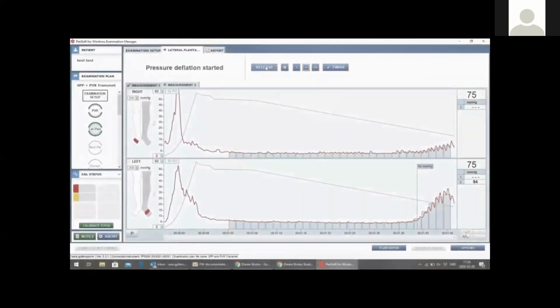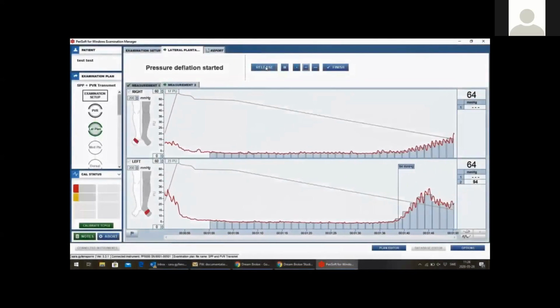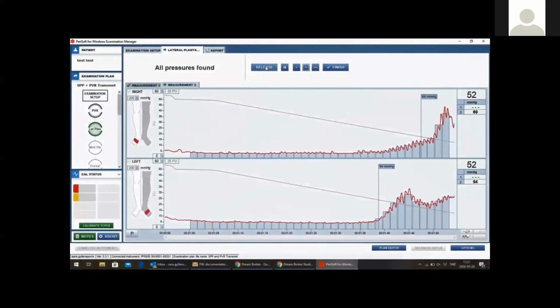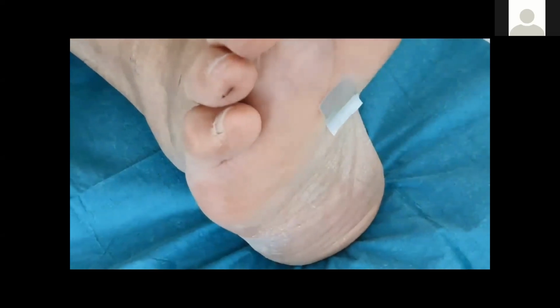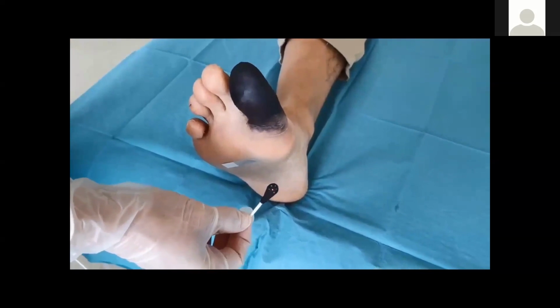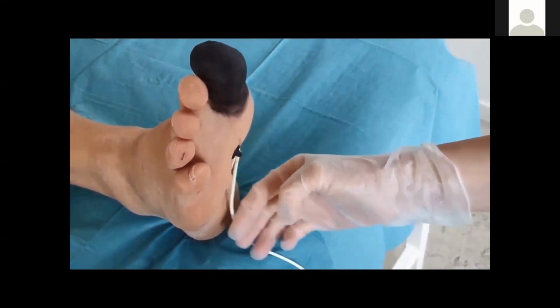The skin perfusion pressure, SPP, is a microcirculatory blood pressure. SPP is useful for wound healing assessment and amputation level assessment. A probe, either with or without heat, can be used for the SPP assessment. The probe is attached with double-sided adhesive tape. The laser Doppler technique is a sensitive method to assess SPP. The probes can be attached both on the plantar and the dorsal side of the foot.